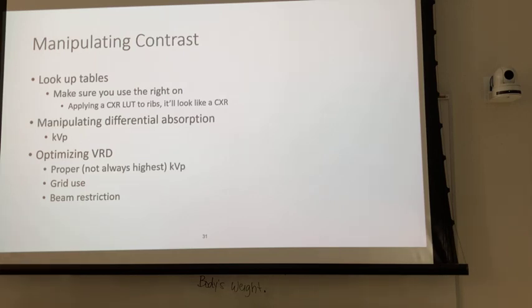Theoretically, you should, because again, what you're processing is under different computer algorithms, one for high contrast. You remember talking about the H&D curve on Wednesday, and we're going to talk about it again here in a bit, but one has a high contrast, which is a very vertical H&D curve assigned to that lookup table. That will be the hand, and the chest X-ray would be very horizontal.